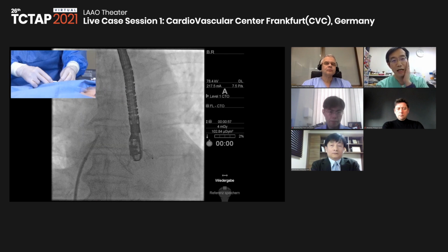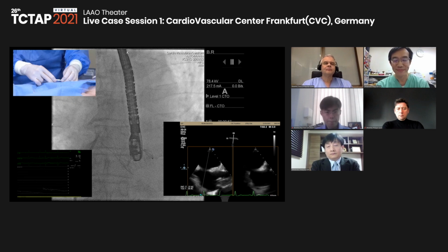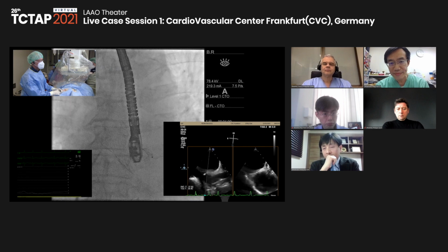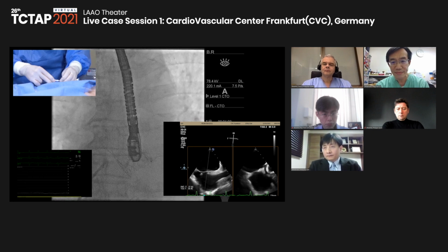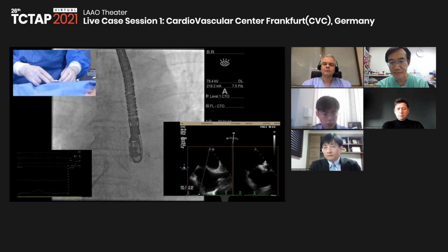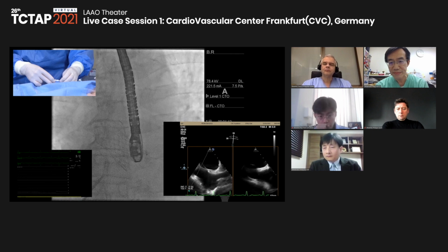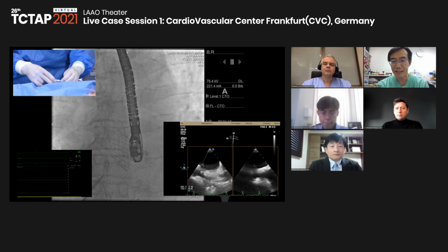You see the patient also has a TAVI device. Yes, the TAVI was implanted back in October last year. You see the tenting on the TEE of the septum secundum right there, exactly. I'm slowly coming down. I rotate more to 6 o'clock. I want to puncture in the inferior segment of the septum, and I would like to go a little bit more posterior, inferior; that is where we want to puncture. Can you give a little bit more gain on the right side especially? Okay, you see the tenting. I think that should be a good position.